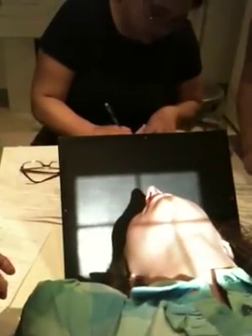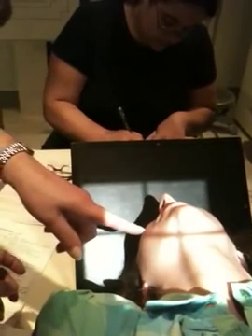So you're going to get a seat — bring it over here because you're going to shoot here, not to the middle anymore. Right here. Then we can bring this over. So basically the CR is right there, right? Okay, and then collimate — you just collimate to that side.